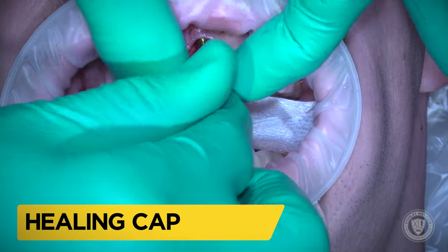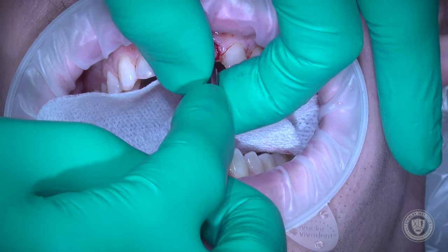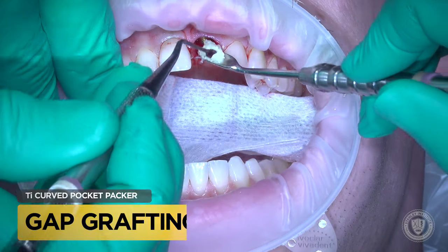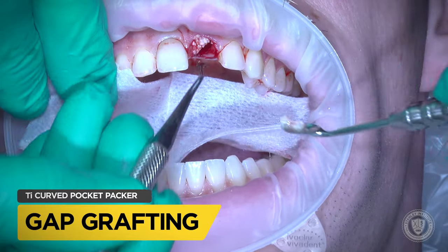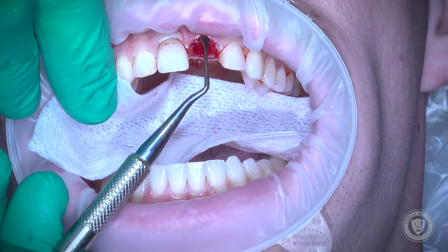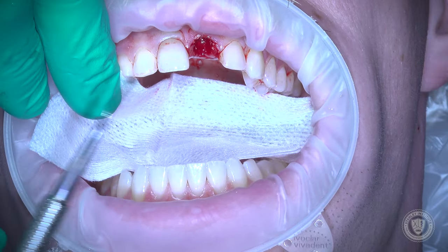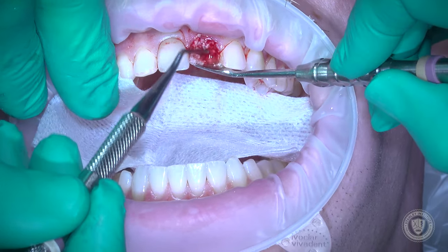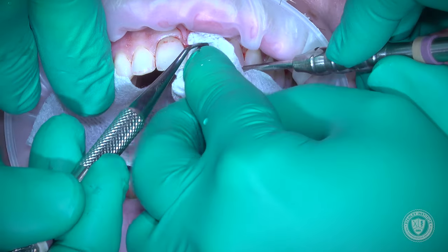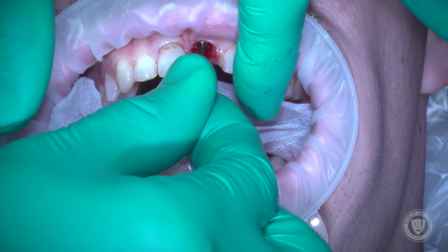We're going to place a healing cap on top of our implant temporarily because we're going to graft around it — gap grafting. We're using Mineros, which is a cortical cancellous chip, and the Salvin curved pocket packer — the titanium curved pocket packer. That allows you to get down and condense the bone lightly around the gap between the implant and the walls of the socket.